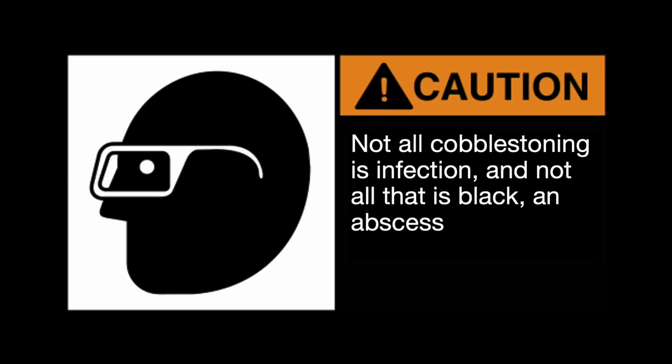Note though, as we have already mentioned, not all cobblestoning is infection, but rather cobblestoning just means soft tissue edema. Additionally, not all abscesses are anechoic, and not all that is anechoic is an abscess.